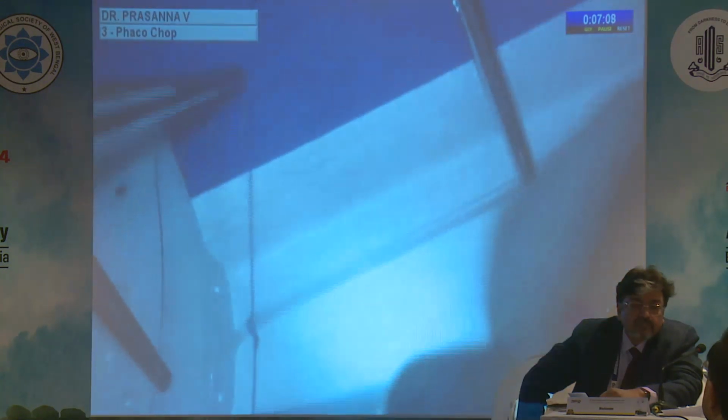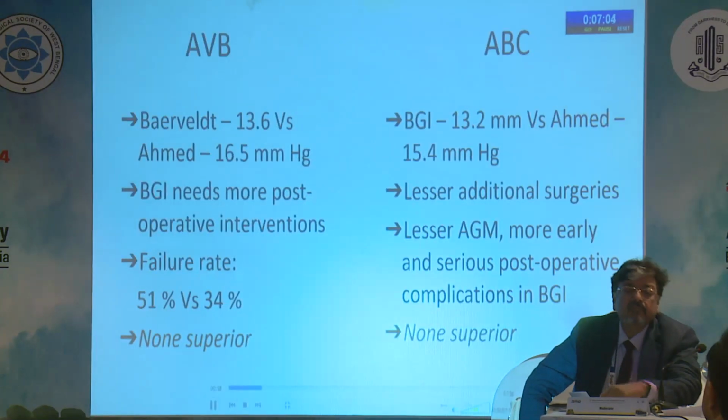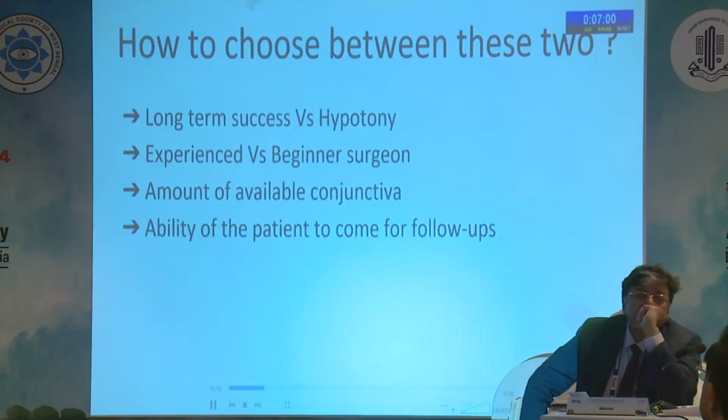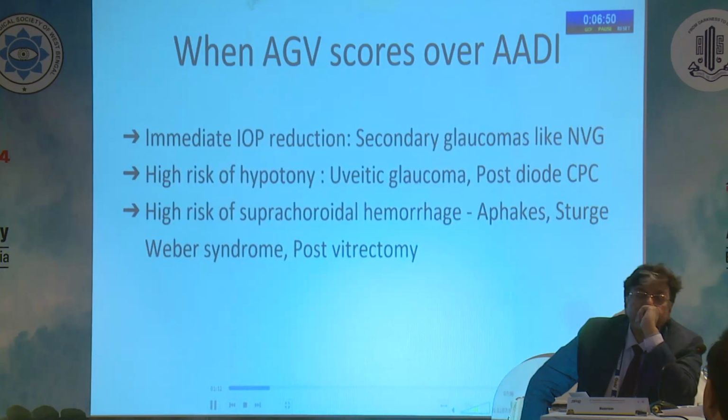Complete ligation of non-valved devices cannot be overemphasized. Though subtle differences exist, none of the two is superior in the long run. If so, how to choose the one for our patients? It depends on the type of glaucoma, condition of the eye preoperatively, and the experience of the surgeon. There are, however, certain indications when a valved implant is better than a non-valved.